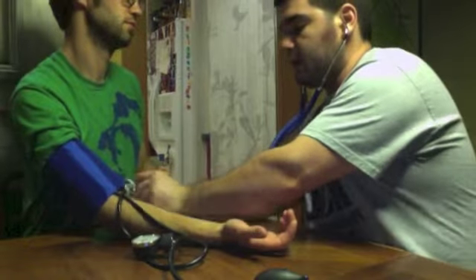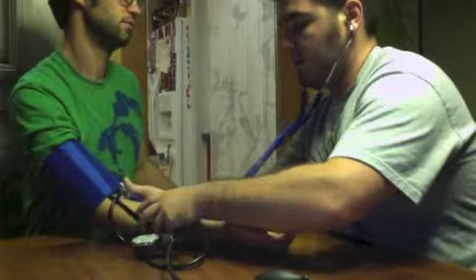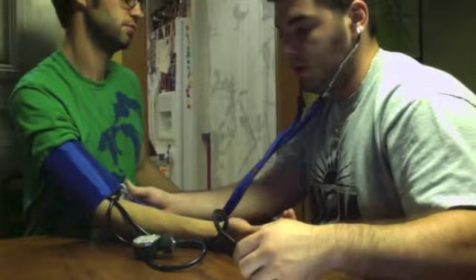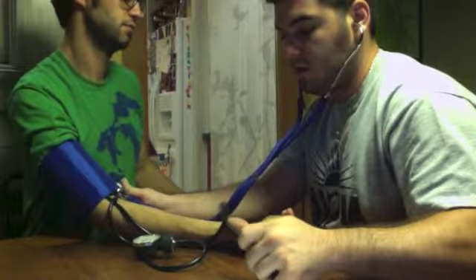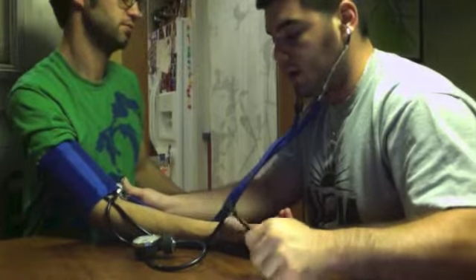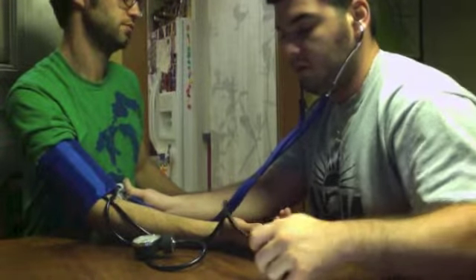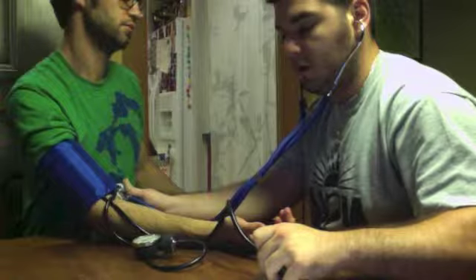I'm going to slide the stethoscope under here, pump up the blood pressure cuff to about 180 millimeters of mercury. I'm going to slow it down. I'm going to listen for that first Korotkoff sound.